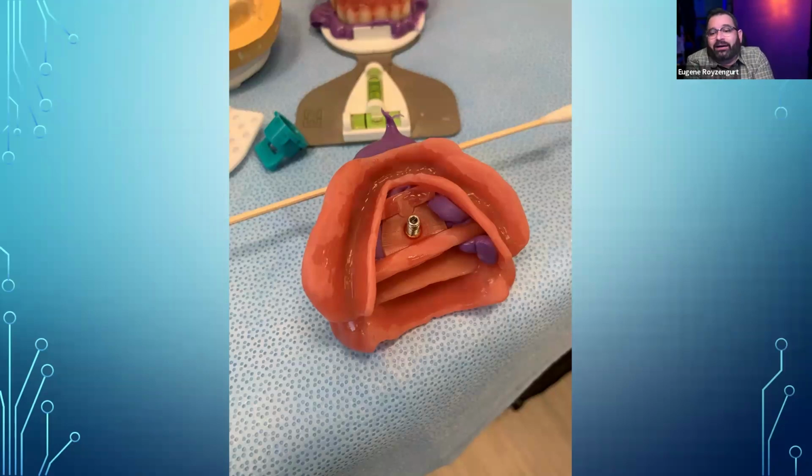But if you don't have that option, let's say, for example, a patient comes in with severe periodontal disease, class 3 mobility. You can't even take an impression on this patient, and the patient blatantly refuses to do extractions first and be edentulous for a certain period of time. Then we will do an intraoral scan, because a lot of times we can't take a whole impression.